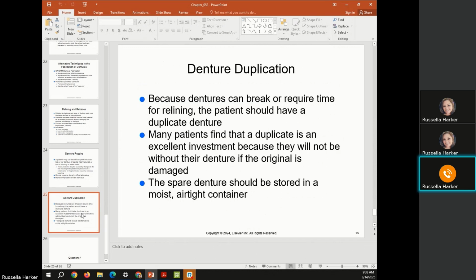The smile line represents the area of the teeth that is visible when the patient is smiling. And the canine eminence is the vertical line that indicates the locations of the canines. We want to look at all of that and make sure it's in the right spots. If not, we want to move it because these teeth are set in wax. It's easy to move so that the lab can change where those teeth are set and then send it back to us to try again.